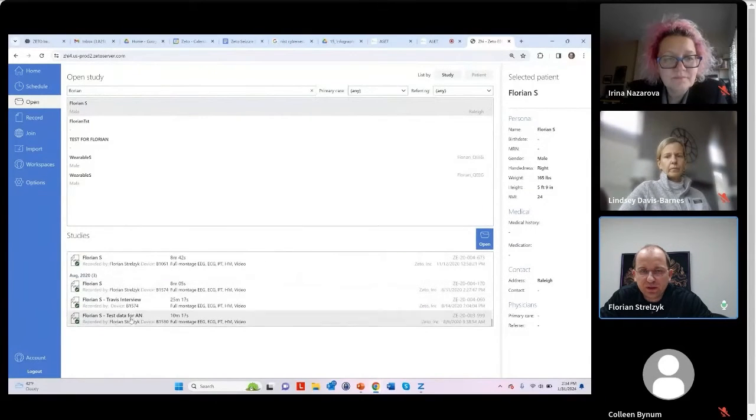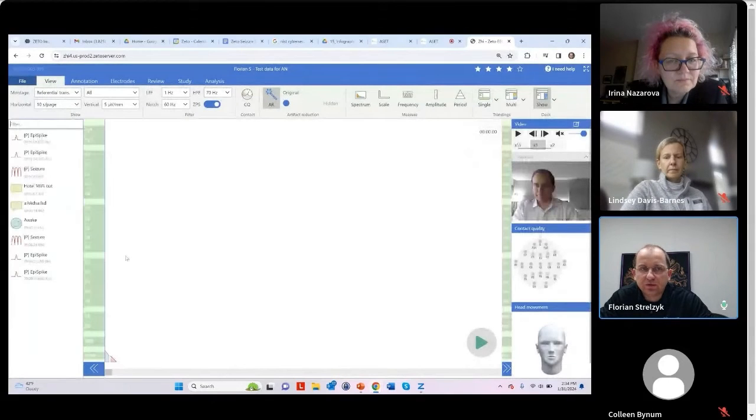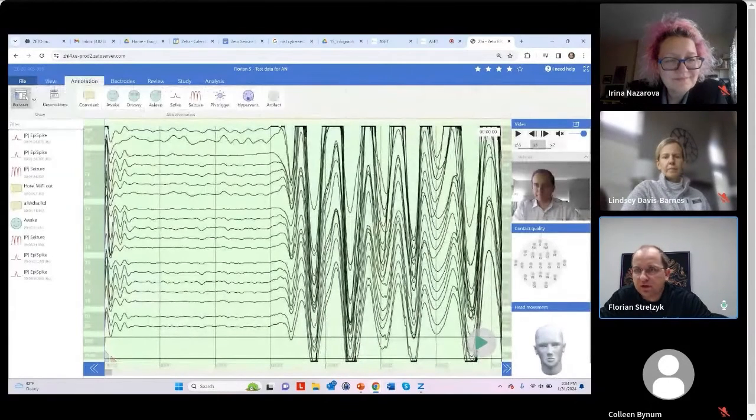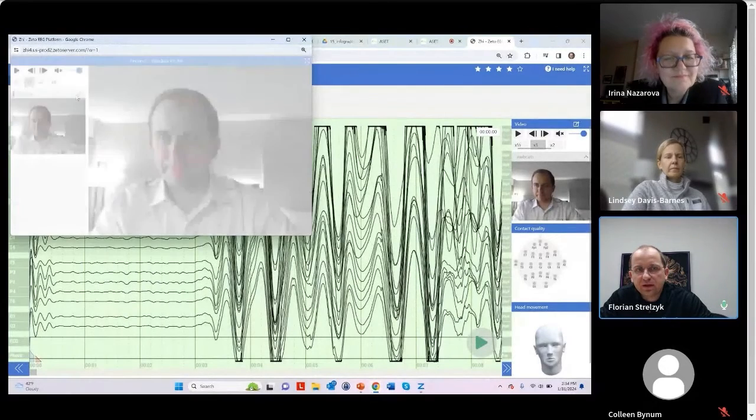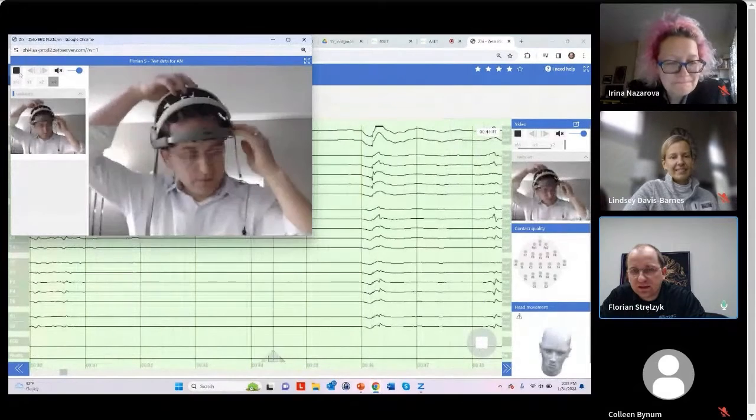And I can open one up. Let's use this one here at the bottom. And now you're able to see this recording. You see my video that I can now start playing. But now you see me setting up the headset.